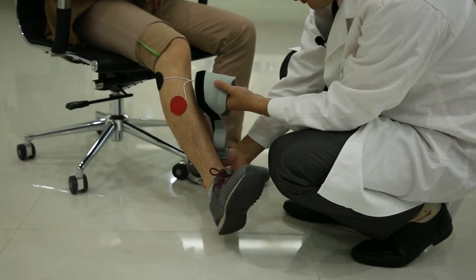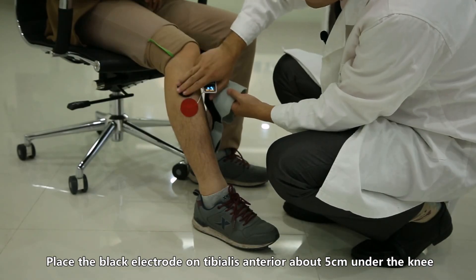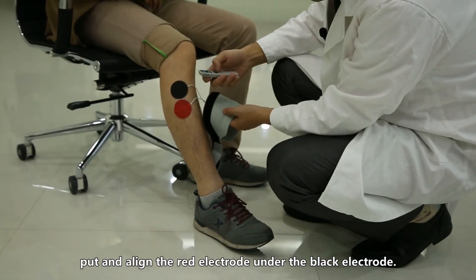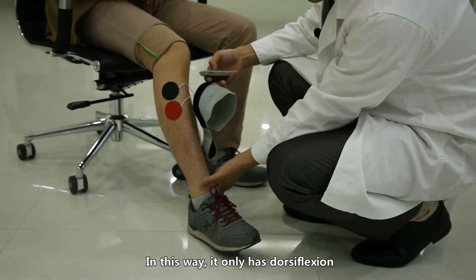Place the black electrode on the tibialis anterior about 5 centimeters under the knee and align the red electrode under the black electrode. In this way it produces only dorsiflexion.